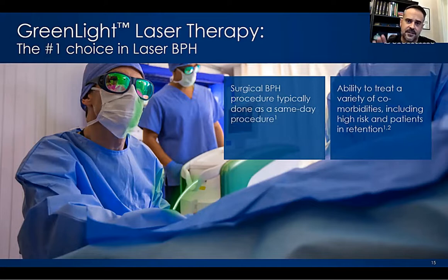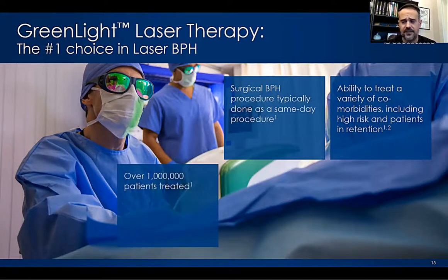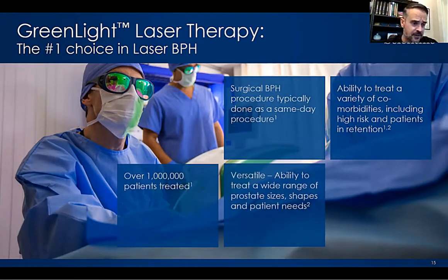The various comorbidities in the high-risk patients, I think we all know that the bleeding issue that we'd run into with TURPs and someone who's anticoagulated versus green light laser, it's far more superior. It is a therapy that's been around for years. Certainly, I'm young enough, old enough, depending on what your perspective is, to have been involved in treating patients early on with the 80-watt laser. And as things improved over time to the high-powered laser, was able to appreciate the advantages of what improvement in the green light technology really brought to the patient.